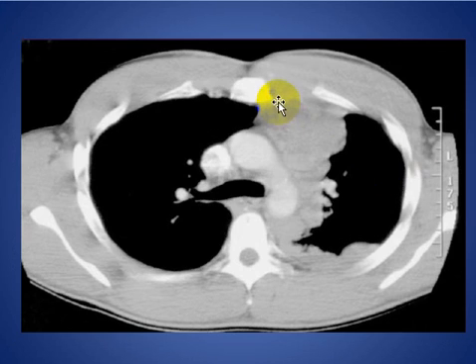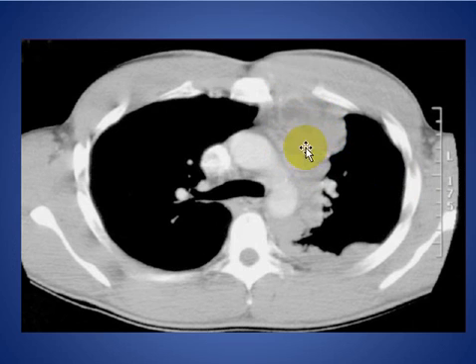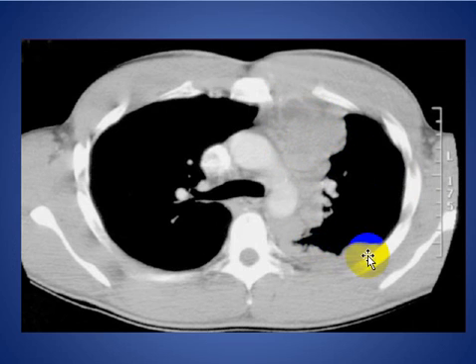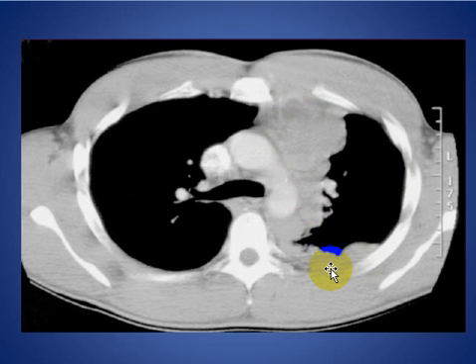Here is another anterior mediastinal mass, midline to the left side, associated with drop metastases. This is an invasive thymoma.